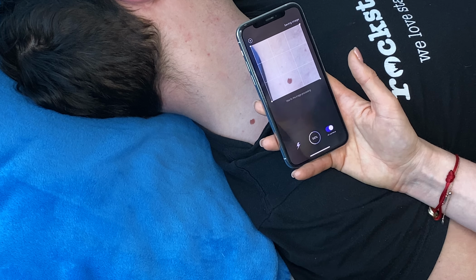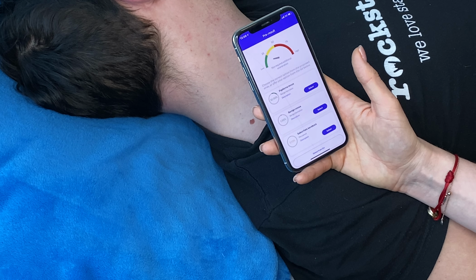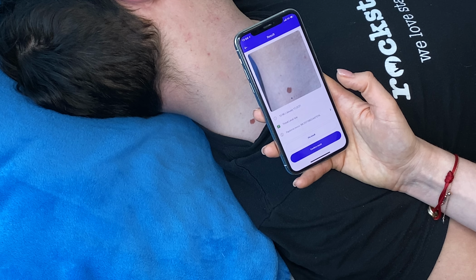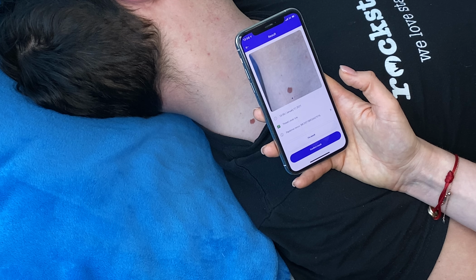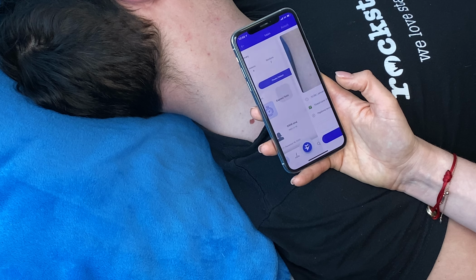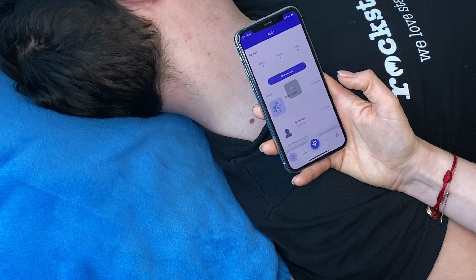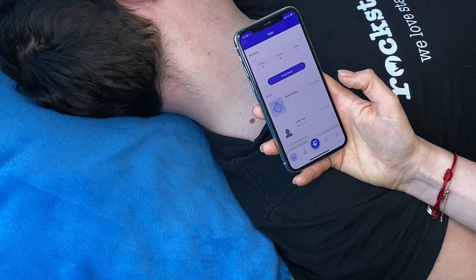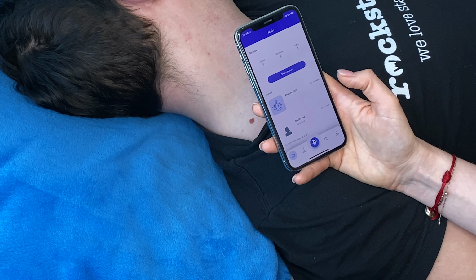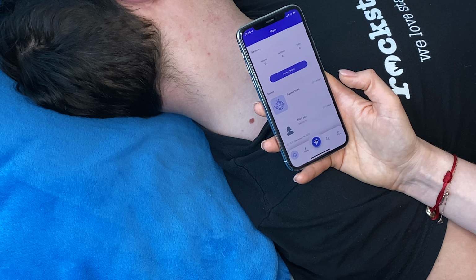Waiting for image processing and waiting for our result, which is 98% papilloma nevus. Select the result and we confirm the result, as I agree with the result of Skinive. And this result goes to the base of Skinive MD. This result goes to the base of the app.